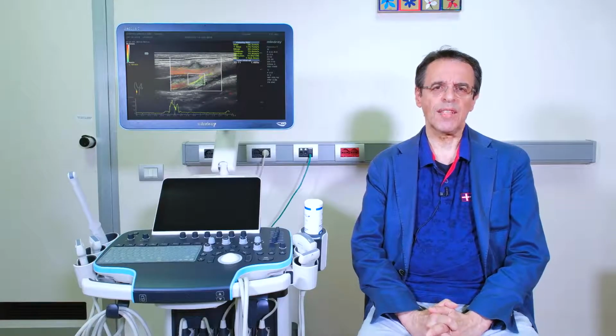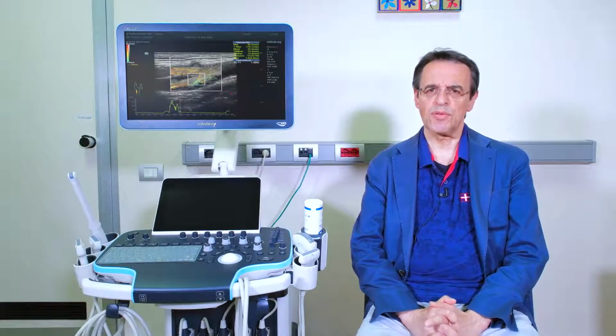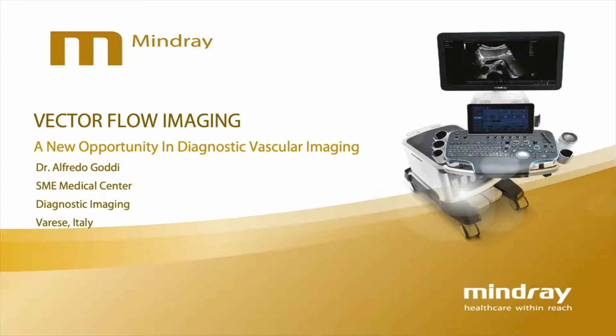In the last few years, I have concentrated my attention and academic papers on the clinical application of vector flow to the carotid bifurcation. In this presentation, I would like to show you the new opportunity in diagnostic vascular imaging offered by the vector flow technique.